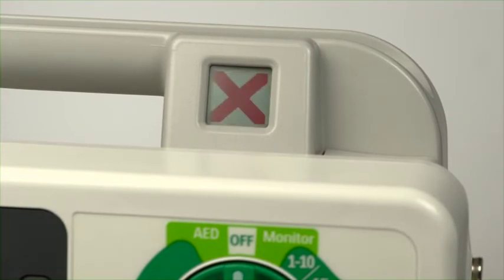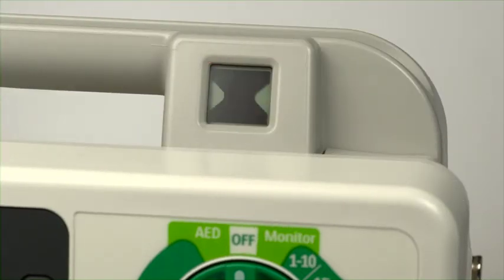A blinking red X and a periodic audio chirp indicate either a low battery condition or no battery is installed and the device is running on AC power. The device can be used, but its operation time is limited. If a battery is inserted and charging, the audio chirp is not present. A solid red X and a periodic audio chirp indicate a failure has been detected that may prevent the delivery of defibrillation therapy, pacing, or ECG acquisition. A solid red X without periodic audio chirps indicates either there is no power available or the device cannot power on. If, after power is supplied, the indicator reverts to the blinking black hourglass symbol, the device is once again ready for use.